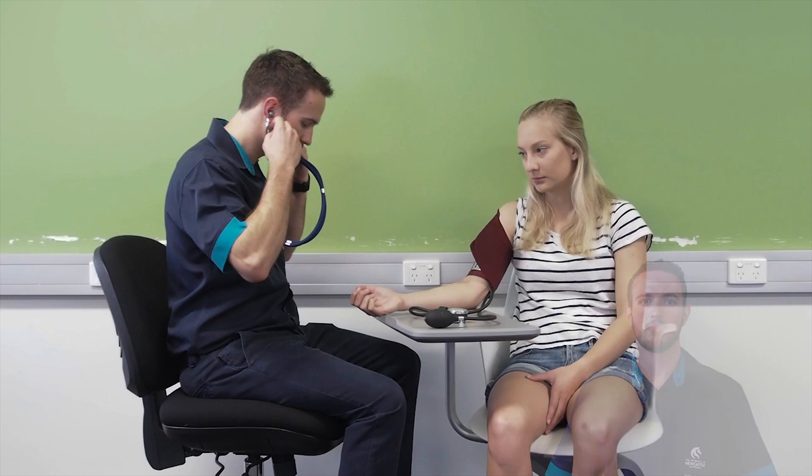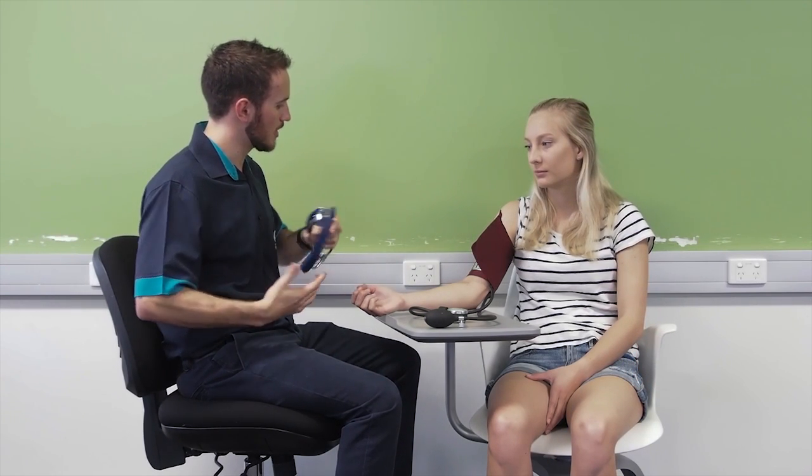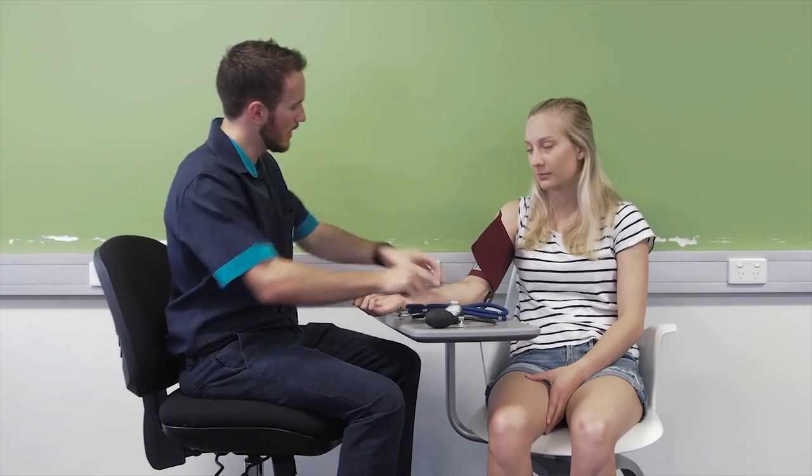If this is the initial assessment, wait two minutes and repeat the same process on the opposite arm. Average out the readings and in future use the arm which provides the highest pressure. If there is a difference of more than 10 millimetres of mercury between the arms, notify a medical officer. Because this is the first time we've taken your blood pressure, we'll wait a couple of minutes and then do it on the other arm.